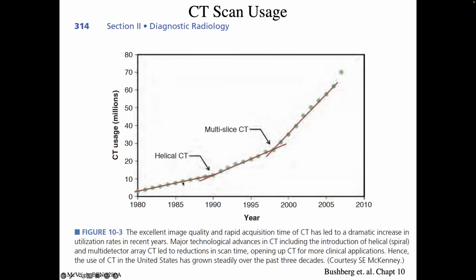So helical CT happened here. So this was all before helical CT. And the one thing about helical CT, which is the magic, was you could read out signals and power everything on the detector through brushes. And there's copper ribbons on the outside of the gantry, and then you had conducting brushes. So all the signal went across that. So now you can just rotate it in one direction continuously.